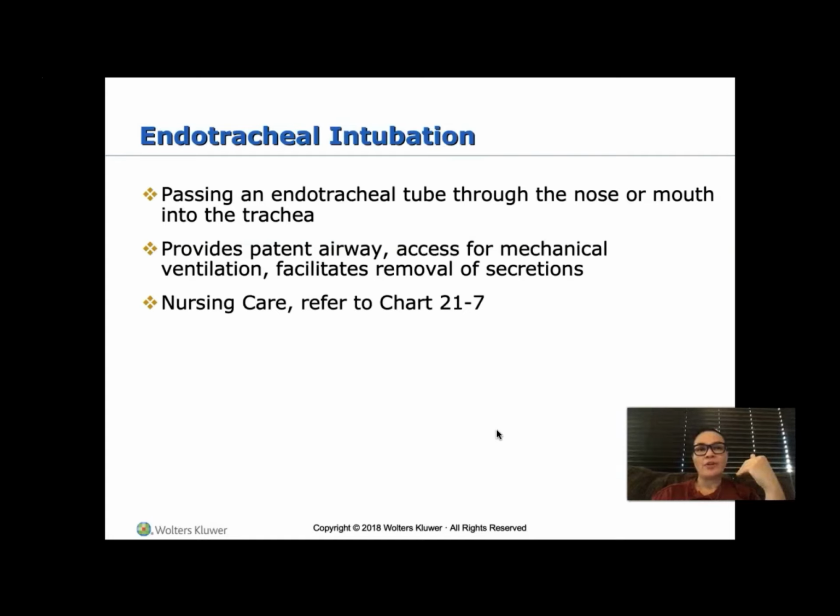I'm going to try to find a video before lecture. As we intubate, we are there to support the patient, hold the patient. The patient more than likely will be sedated. A balloon to keep the tube in place is placed right here with the tube to hold it in place. So just remember that. Any movement or tugging in this area can cause permanent damage, okay?